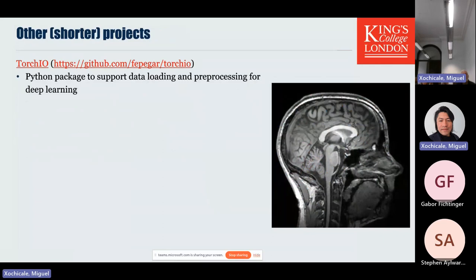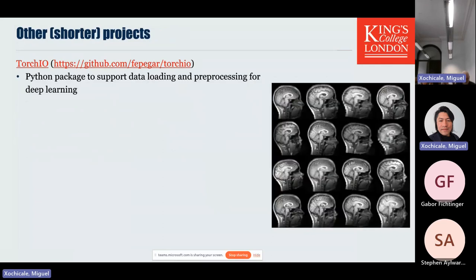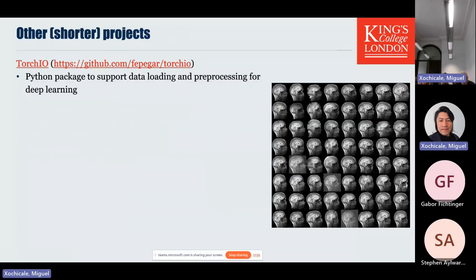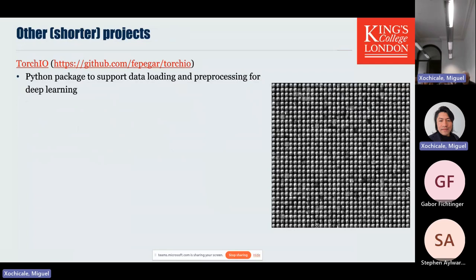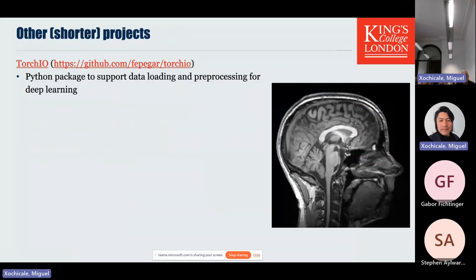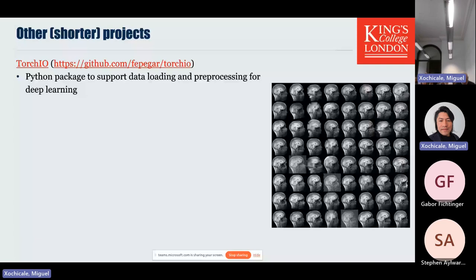So then we've had a couple of other shorter projects that are also open source. One of my students created a Python package called TorchIO, which is really just about being able to load in imaging data for deep learning and do some data augmentation. So this is just a little GIF showing you that you can do rotations, you can degrade the images, et cetera.